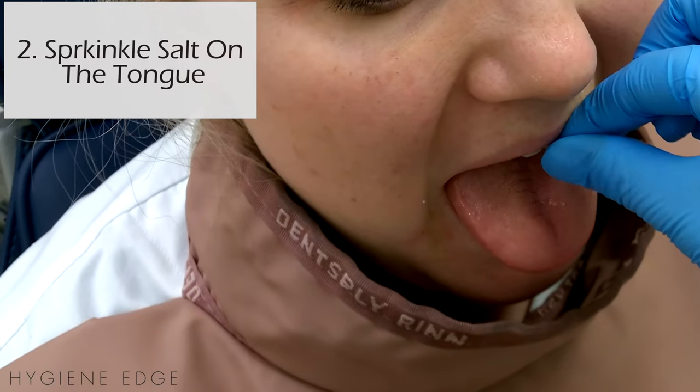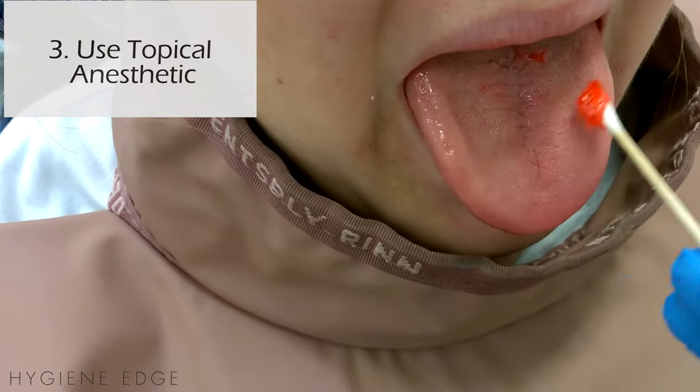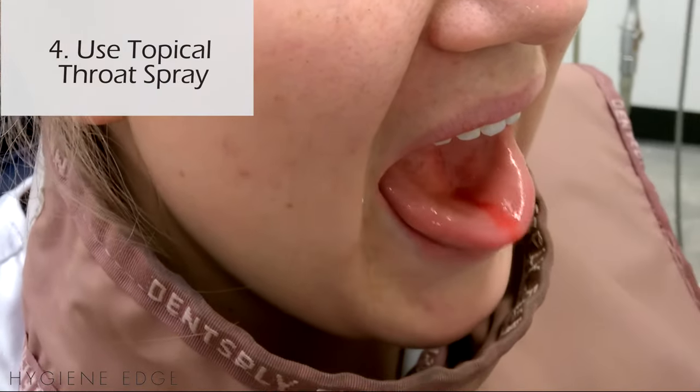Sprinkle a little salt on the tongue. Place topical on the top of the tongue and the lateral borders. You can also use a numbing throat spray on the back of the throat.